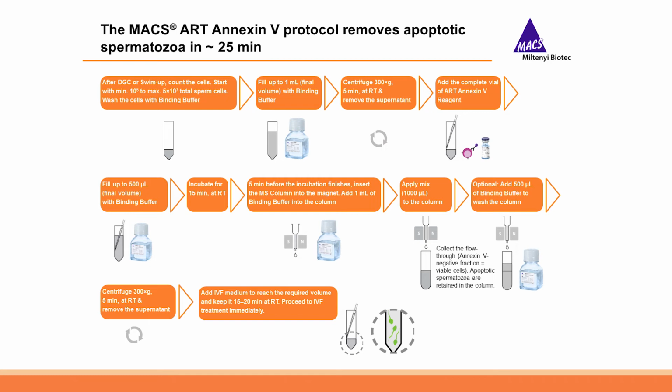And finally, you can resuspend the pellet in a sperm washing medium, a sperm buffer, and keep it for 15 to 20 minutes at room temperature, and then proceed to any IVF treatment that you would be performing afterwards.